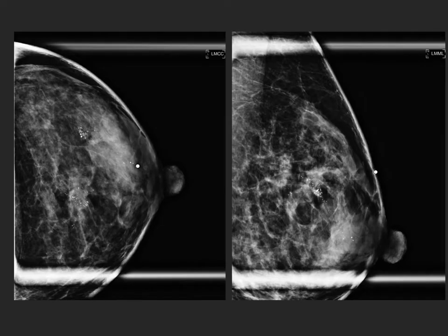Before you start the biopsy, you have to identify to the technologist what approach you're going to use. Generally speaking, you want this to be the approach that's closest to the skin surface, or sometimes you're going to want to be using the approach that would allow you to distinguish the calcifications best. Let's illustrate this on this patient. So we have our CC view and our two lateral view, and this patient has three groups of calcifications.